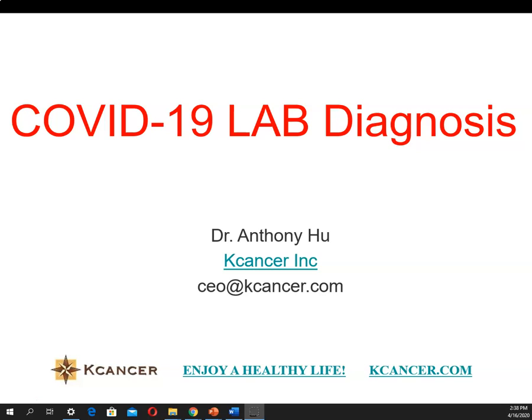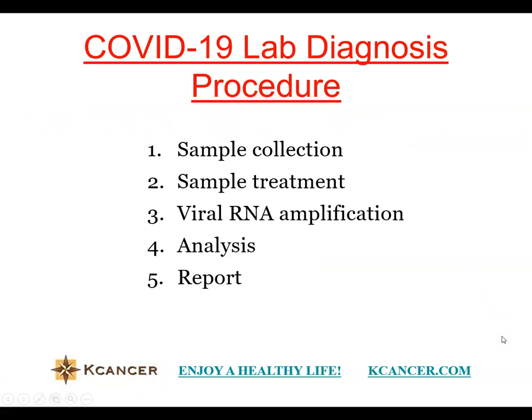Then we come to laboratory diagnosis, just to provide the evidence that you have experienced this virus infection. And here are the basic procedures for laboratory diagnosis.